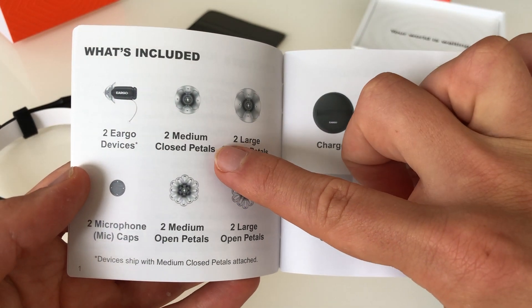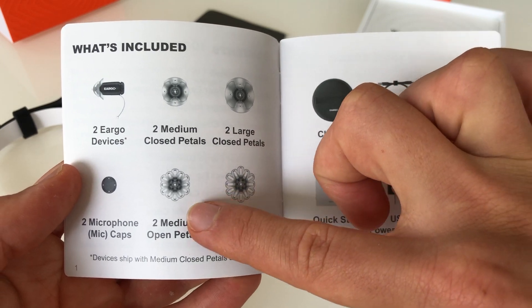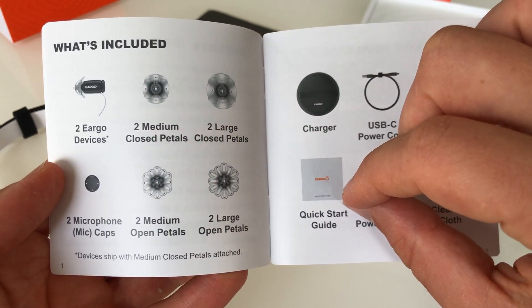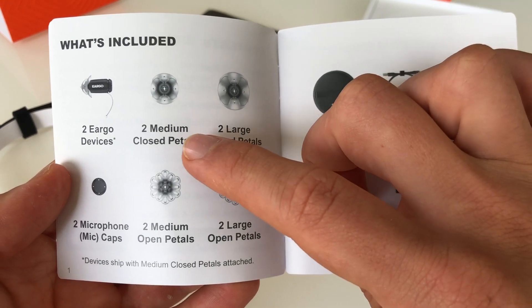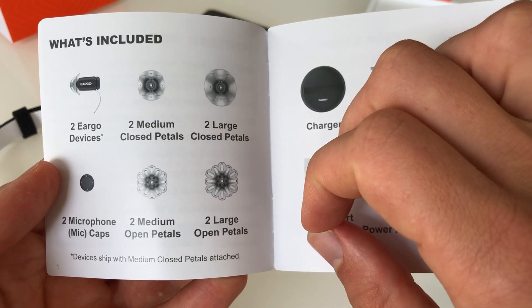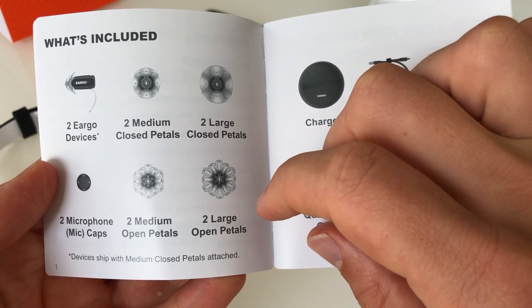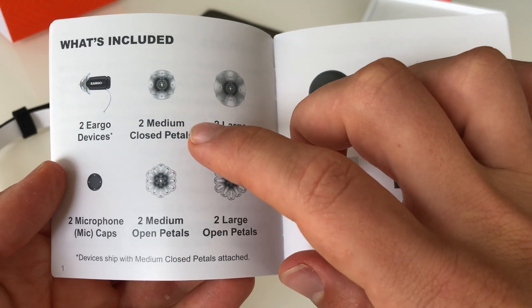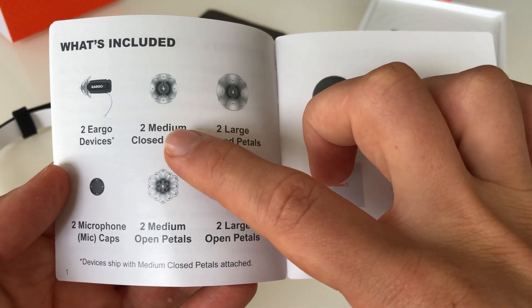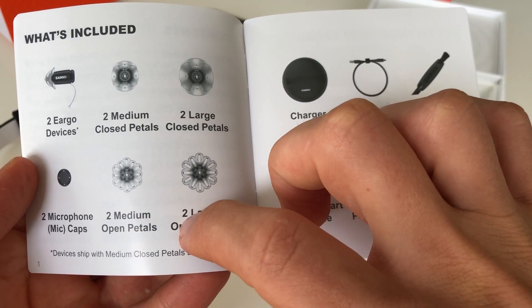You have these petals — the piece that goes on the end of the hearing aid. You can see there's an open and a closed variety. Depending on what you need, speak to an audiologist to determine whether, based on your hearing test, your online hearing test, an in-person audiogram, or your subjective needs, you might change from the closed petals in the medium or large size to the open petals in the medium or large size.